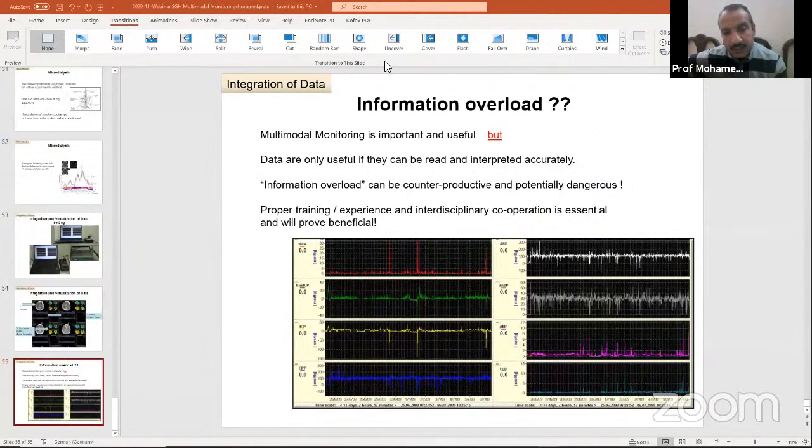Pupillary assessment is the best tool in neurological assessment. I like this question because it's a clinical one. So I need your input about this, please. As Professor Jorn said, this monitoring is for unconscious or sedated patients. So clinically, you will not have more than the vital signs. Blood pressure and bradycardia are good measurements, but sometimes a little bit late.